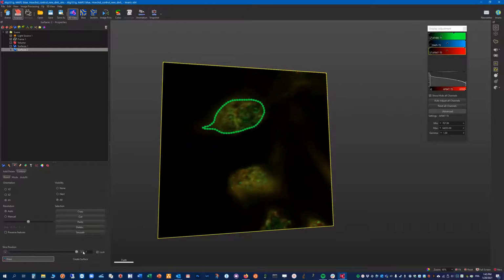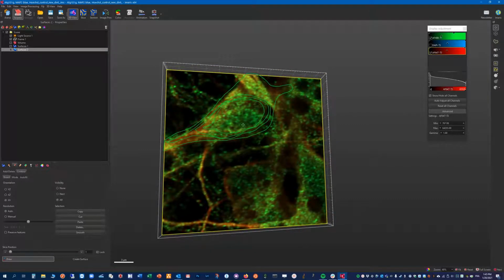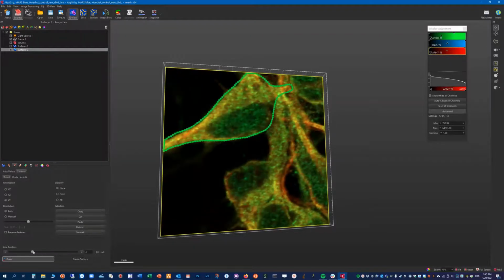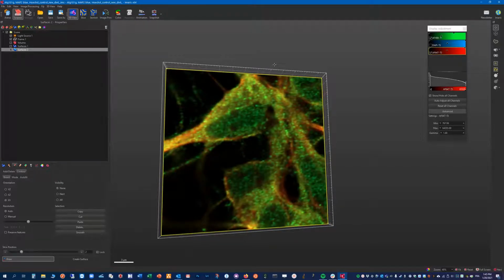Depending on the way you work, you might want to turn off the other lines when you are completing, for instance, the first slice here. So for instance here, if I missed a slice, I can do the contour like this.